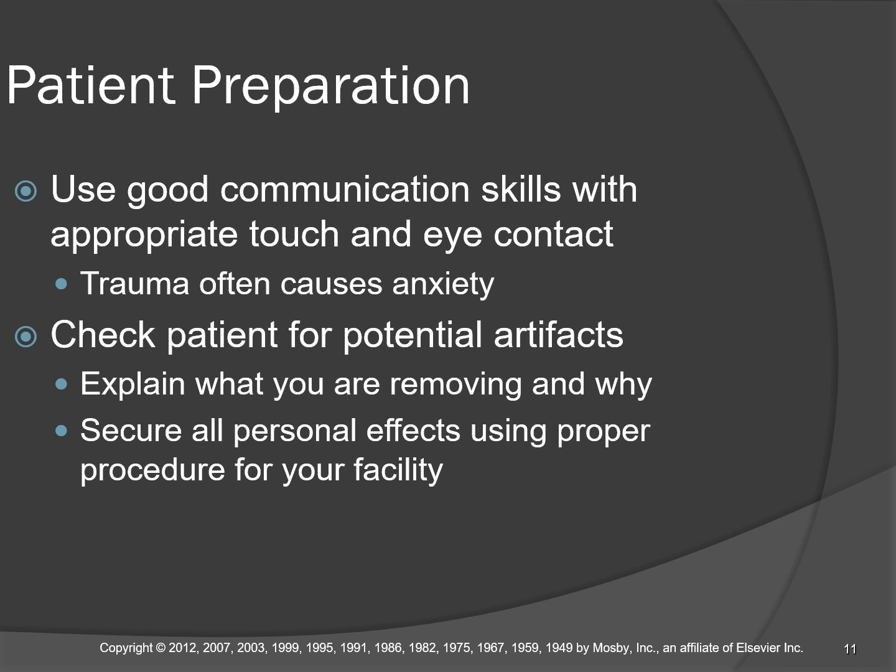All right, so your patient preparation: good communication, appropriate touch and eye contact. Trauma often causes anxiety. Yeah, it does. As far as your patients being nervous and fearful, the worst ones for that, checking that box each and every time, is the trauma patient.